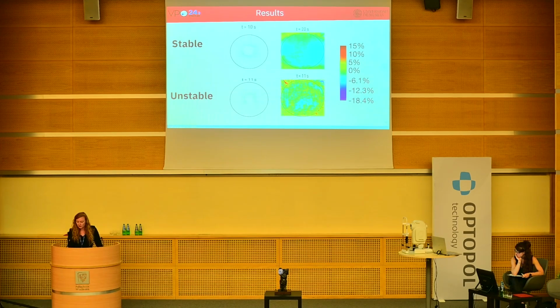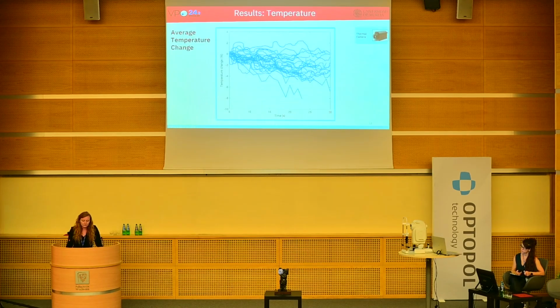This dual channel approach allows for a more local analysis of ocular surface behaviors, given the complementary yet distinct nature of the data obtained from both channels. However, there are preliminary exploratory findings of the subject wearing contact lenses, which may open doors for future research. Moving forward with more global findings.